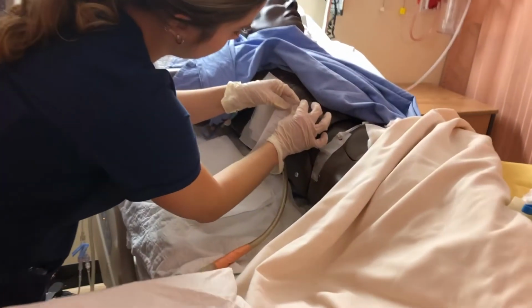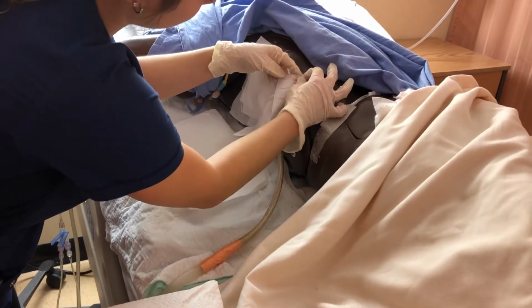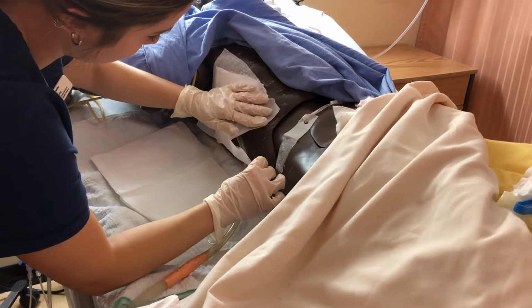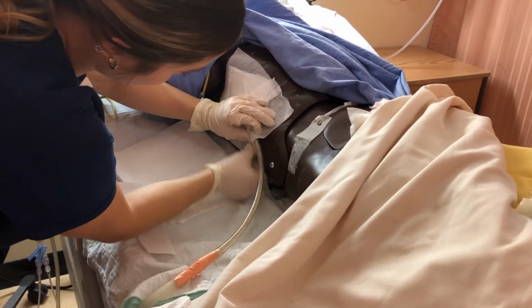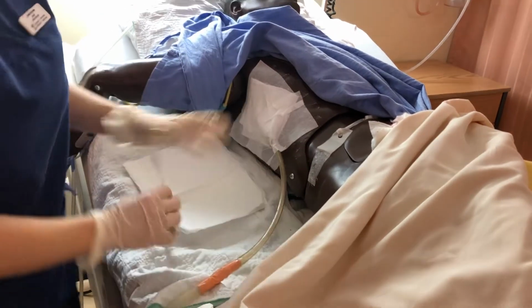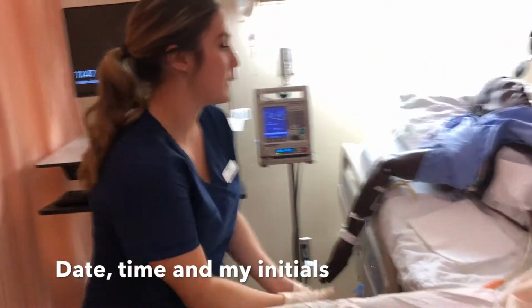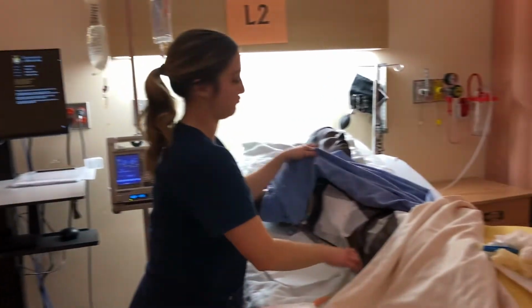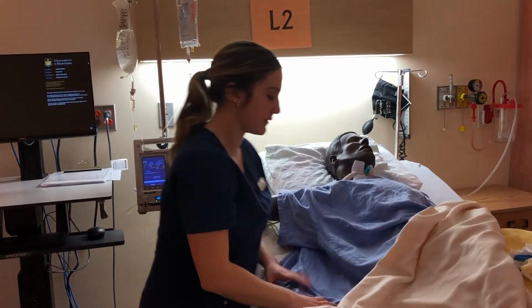40% humidification. We should be at 40%, and it says 40 indicates the amount of oxygen that we need. So it has to be just oxygen. And this is date labeled and timed. And then I would document about the dressing change, if there's any drainage, excessive drainage, signs of infection.